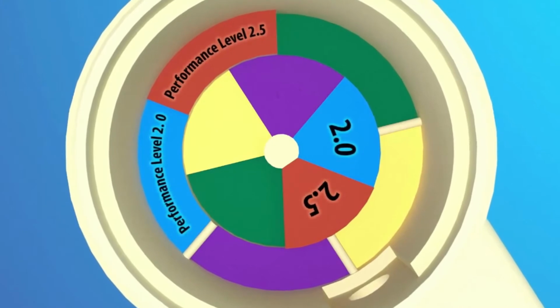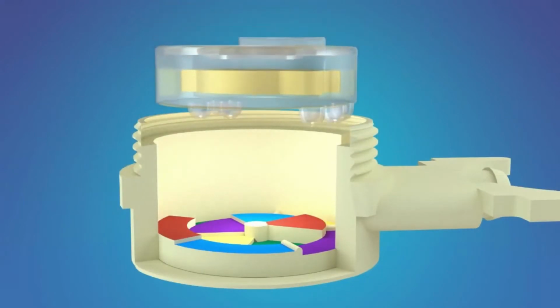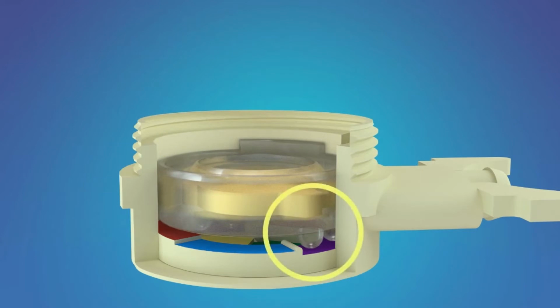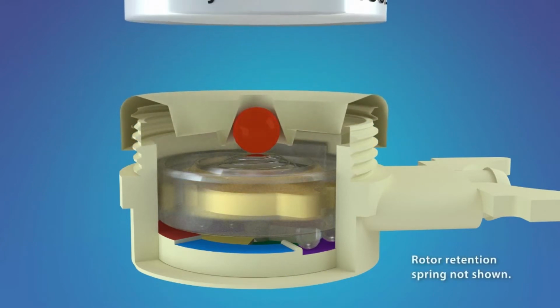At the base of the valve mechanism, there are 5 concentric platforms of various heights. On top of the valve mechanism base is a plastic rotor element which contains a magnet. The rotor element has feet that are designed to engage with the platform stock. Mounted on top of the rotor element is a pressure flow spring which applies pressure onto a ruby ball.